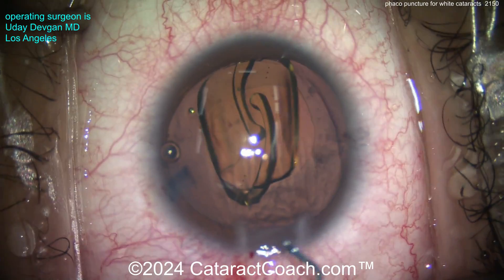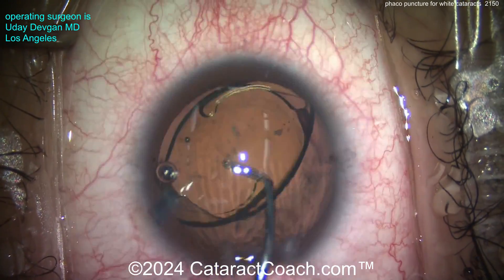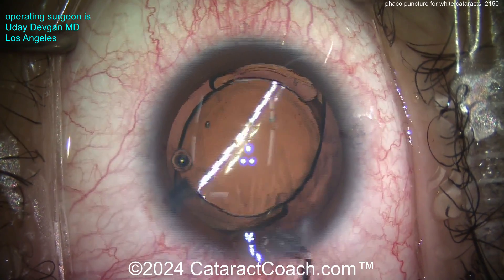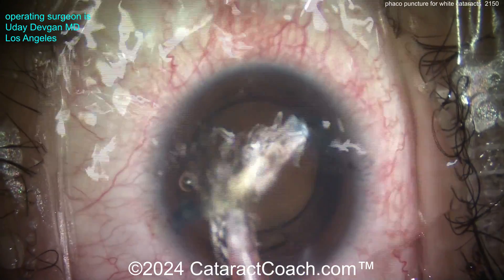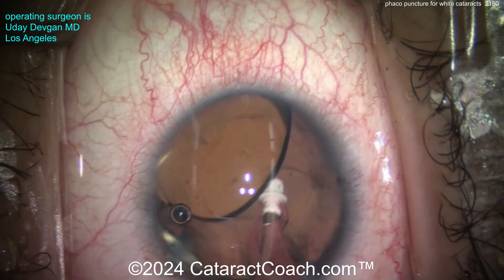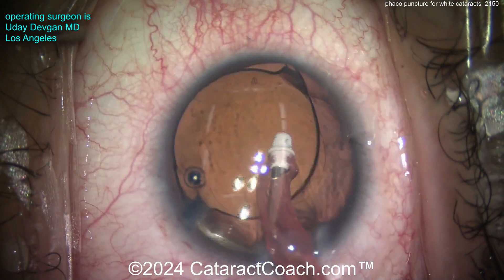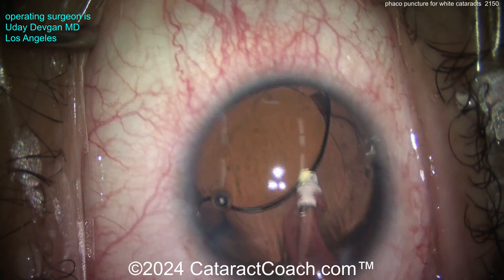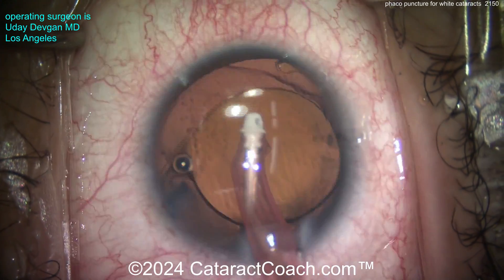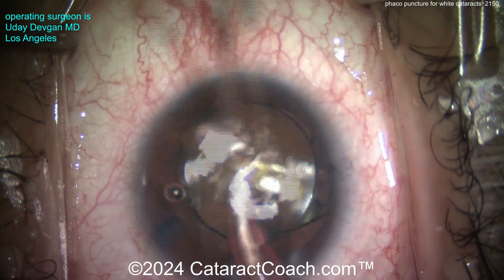This patient is highly myopic and we're aiming for a post-op goal of about minus two. Minus two is a focal point of about half a meter — about 19 inches for our American friends — which is where this patient spends his day using a computer. Minus two is going to be just about perfect for fantastic computer and near vision all day without spectacles. Removing viscoelastic, especially from behind the optic, will help ensure the toric lens stays in good position.